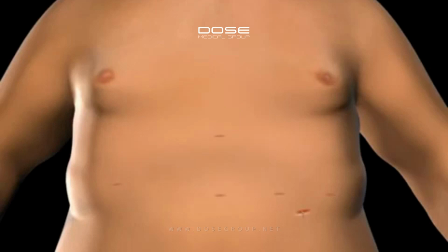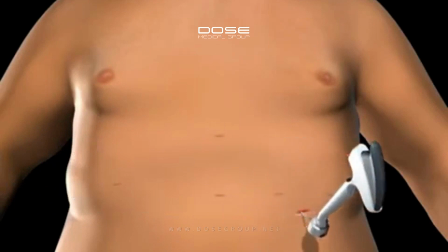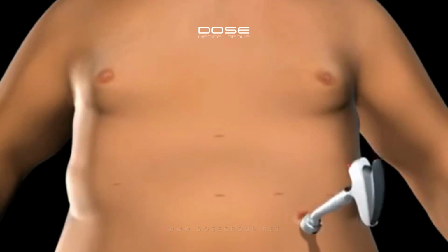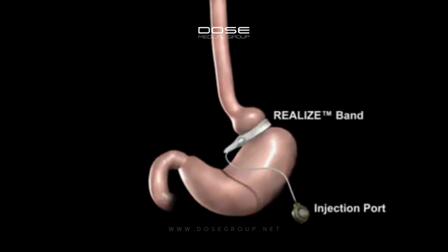An incision is made on the upper abdomen to insert the Realize injection port beneath the skin. The tube is secured using the locking connector on the port. The injection port and tube are placed beneath the skin.